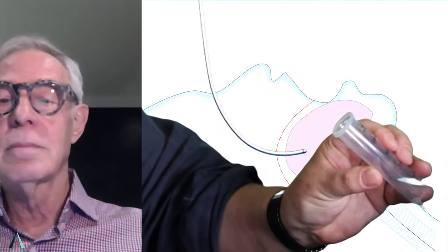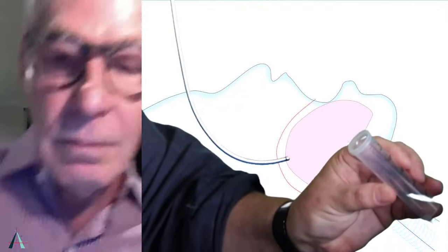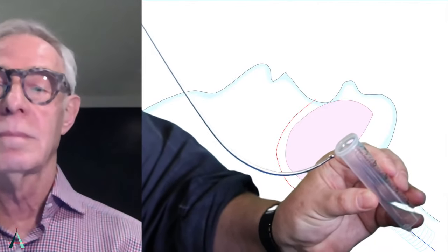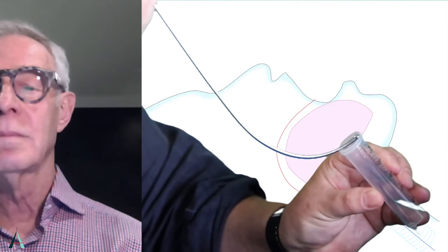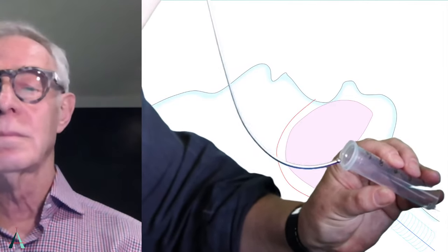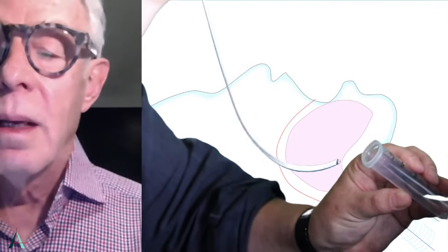But my interpretation of what that's doing is that usually we tend to come in like this, find we're below the trachea, and then angle forwards. And that means we're either impacting the arytenoids, or if we clear them, we end up impacting the anterior wall of the trachea. This lifting maneuver and that slight angulation is bringing us more in line with the plane of the axis of the trachea and making it easier to enter. Is that what it's achieving?